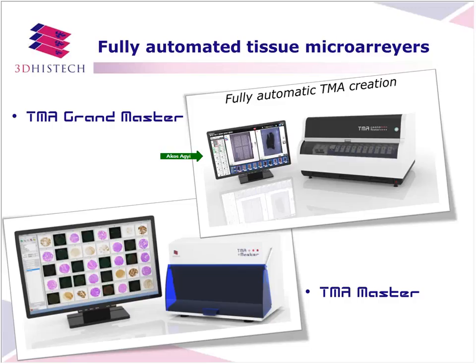It's designed for pharmaceutical companies, biobanks, and big pathology departments. The TMA Master is a small footprint machine which is designed for smaller research laboratories.